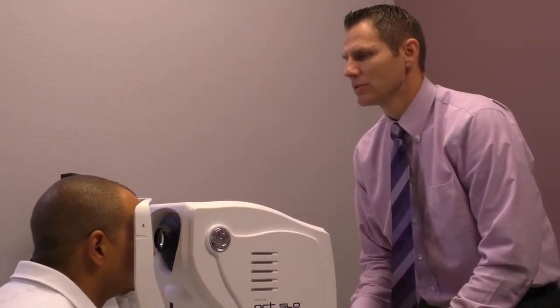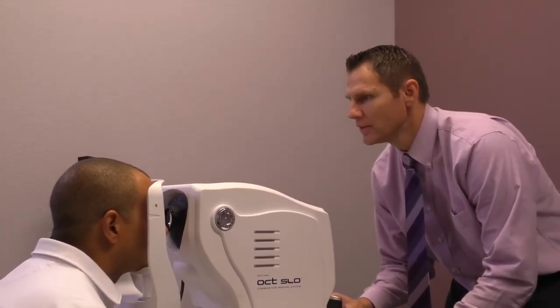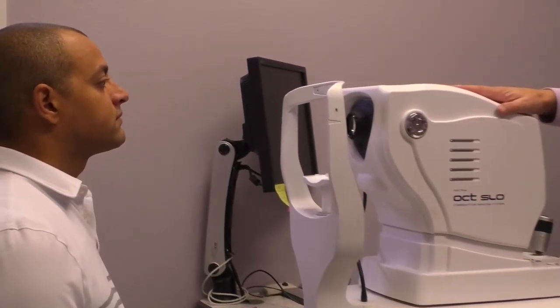Now I'm going to have you blink a few more times, get your eyes relaxed, and look straight ahead. Measuring the nerve thickness on the left eye — open really wide. Hold it there. Perfect, got that one as well. You're good, go ahead and sit back, and we'll review these results in the exam room.